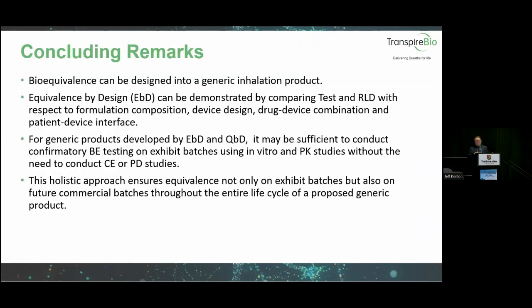My concluding remarks are basically that bioequivalence can be designed into a generic inhalation product, which is consistent with the FDA's guidance on BDP. Equivalence by design can be demonstrated by comparing the test and reference products with respect to formulation composition, device design, drug-device combination, and the patient-device interface. So we already have a wealth of technologies that can be utilized to demonstrate that equivalence has already been designed into the product. For a generic product developed by equivalence by design and quality by design, it may be sufficient to conduct confirmatory BE testing on exhibit batches using in vitro and PK studies without the need for conducting clinical endpoint and PD studies.